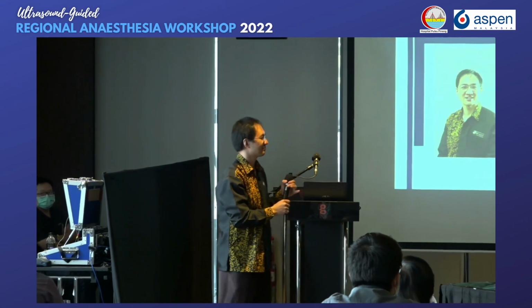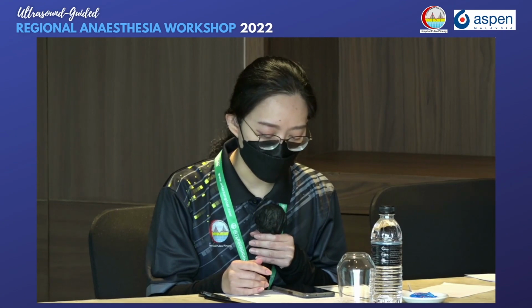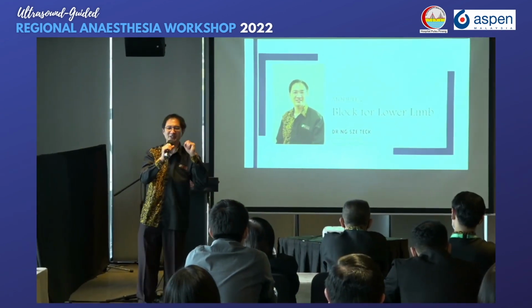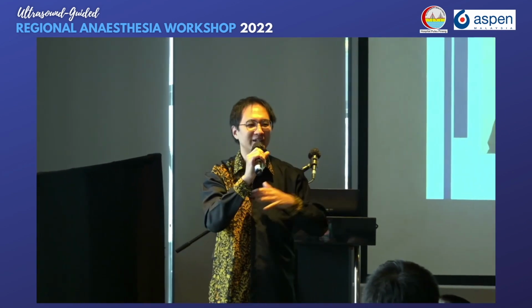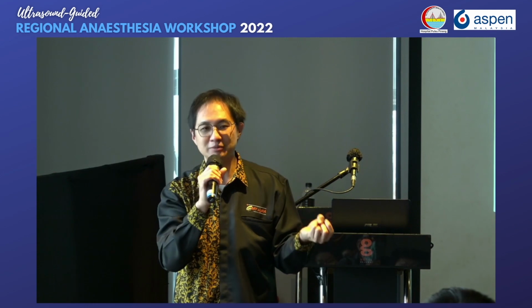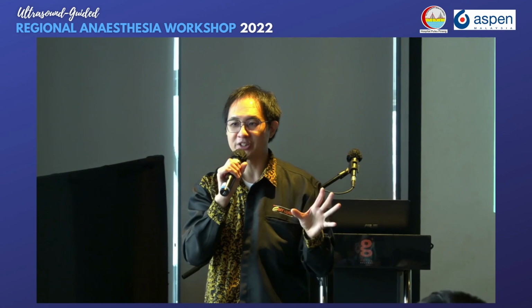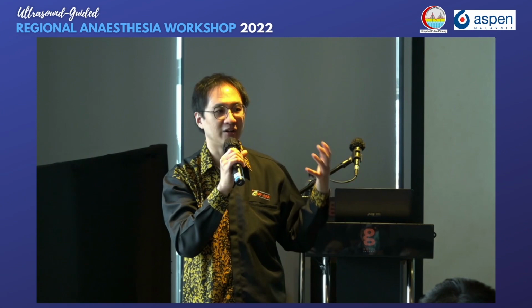Okay, probably this is going to be the last question. Is there a role for a block for post-operative pain, for example, giving a fascia iliaca block for a patient going for lower limb surgery but under spinal anesthesia? Yeah, very good question. Yes, the answer is yes. From my personal opinion and also from the guidelines, yes, even if you give your spinal, the spinal doesn't last long. Probably by 1-2 hours after the operation, the spinal effect on the hip joint is going to wear off already.